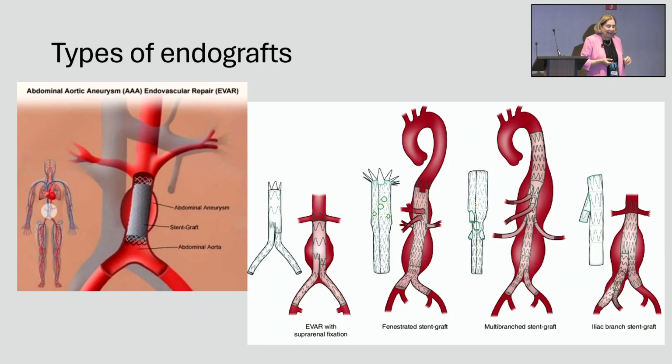I love it. All right, so let's talk just a moment, and I have just a few minutes left, about what you would see. So that's aneurysms, and I encourage you to compare notes with colleagues. We get so locked into a room in the dark by ourselves, we need to sometimes compare with what other people are doing. Endografts come in many types.